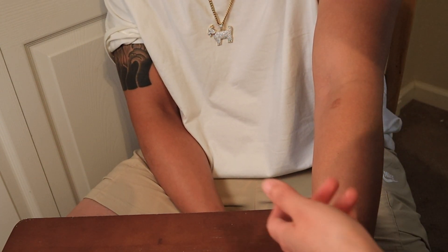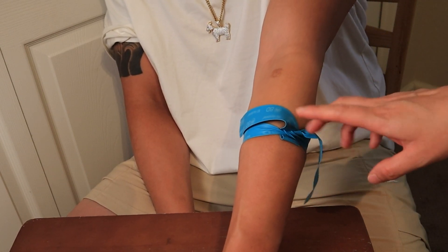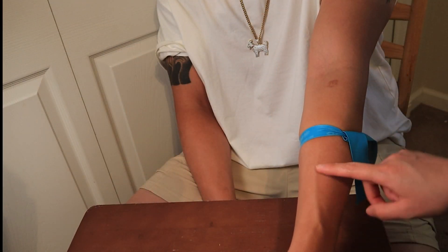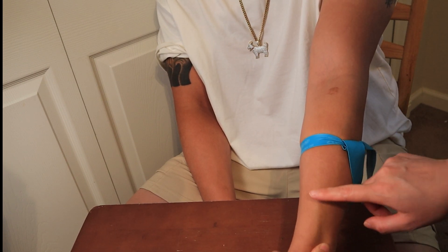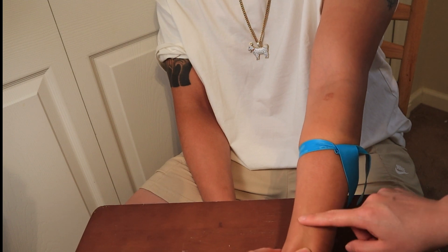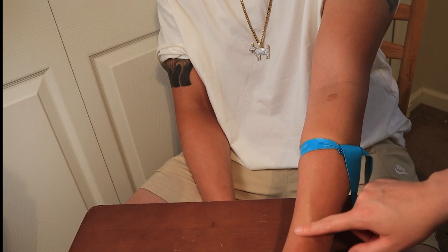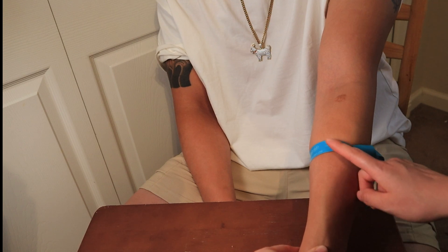If you don't see anything up in the arm, you'll have to move down — but make sure you move the tourniquet down too. The tourniquet should always be a few inches above where you're going to stick the patient. When you do find your vein, check where it goes because sometimes they're really curvy. Try to stick to the straighter veins — it's easier to just go in straight and you're in.